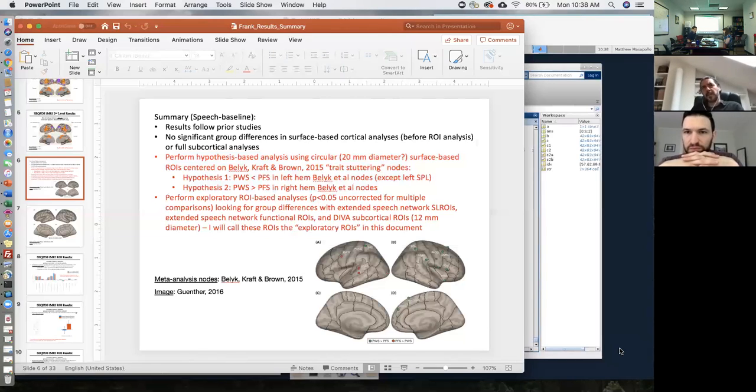And why Talairach space, do you recall? There's the ALE. I don't know if it's ALE software, but all of these ALE papers have just Talairach coordinates. Okay, yeah. I see. That's an additional level of complexity, but yeah. Okay, so in that case, you're going to be entering MNI coordinates for the vertices that you care about, and the software will just make sure it projects those MNI coordinates to the closest point on the surface using the FS average projection, basically.